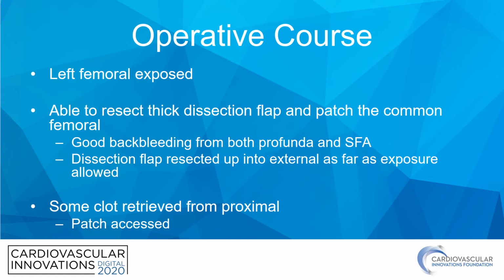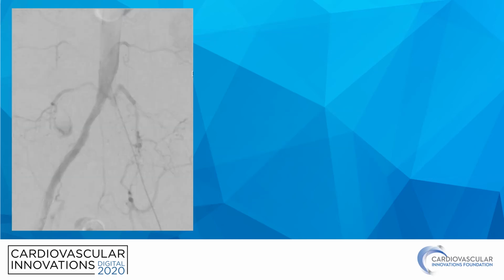The patch was then accessed, and you can see here is the first picture with the left common iliac occluded. However, there did appear to be a little bit of a stump there, but concern was this area did not light up well.